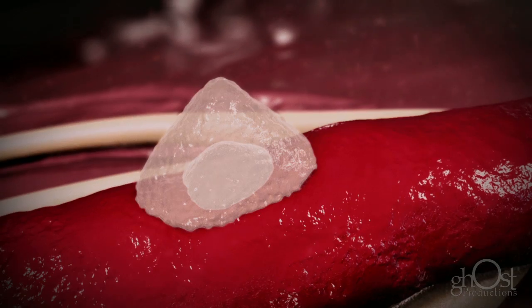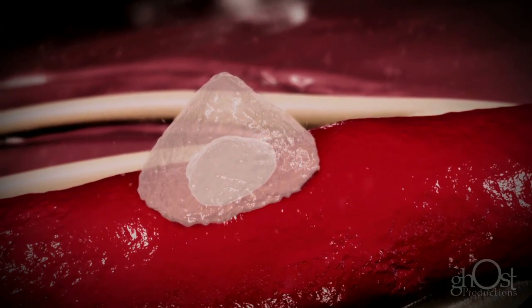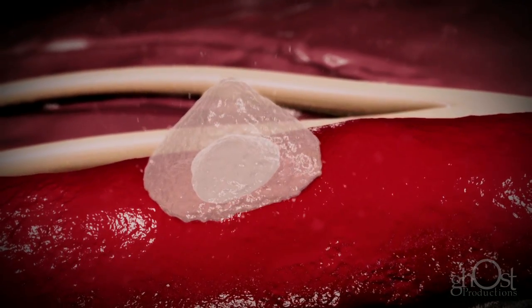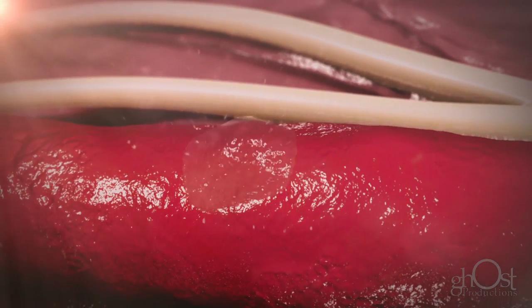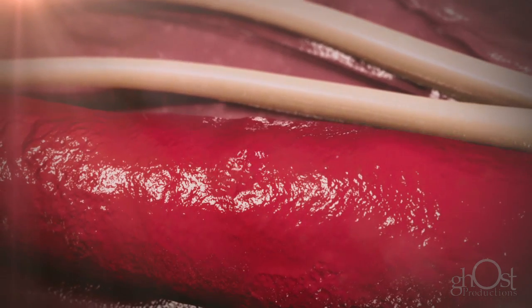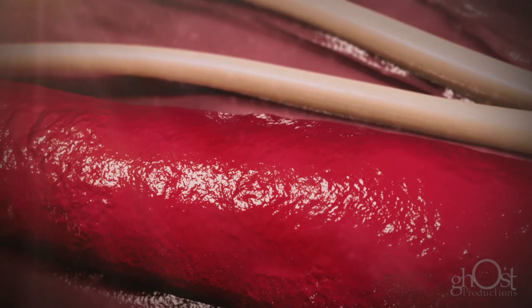The dual-action sealant produces a durable hemostasis and a platform for natural vessel healing. Within 30 days, the sealant is completely reabsorbed, leaving nothing behind but a healed artery.